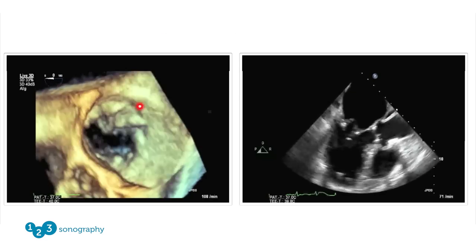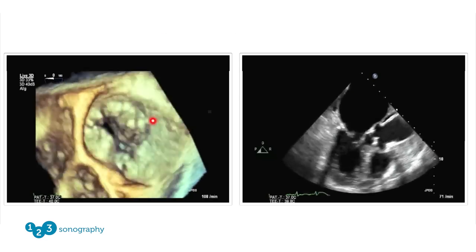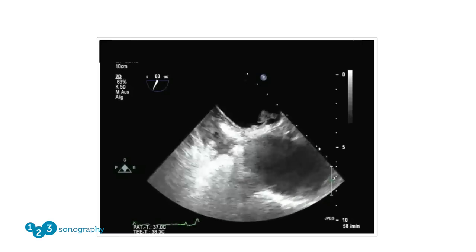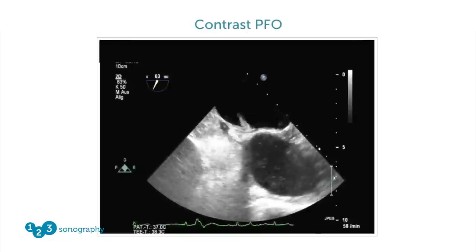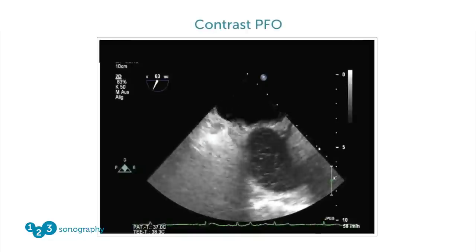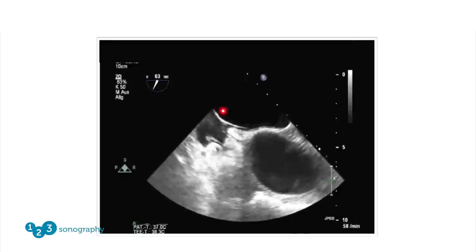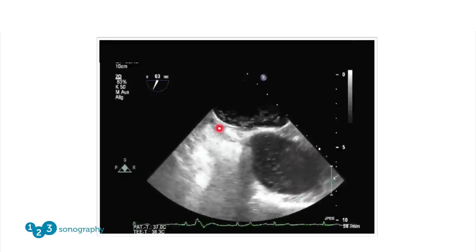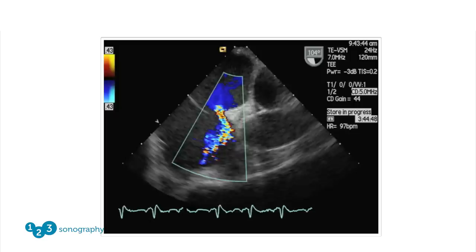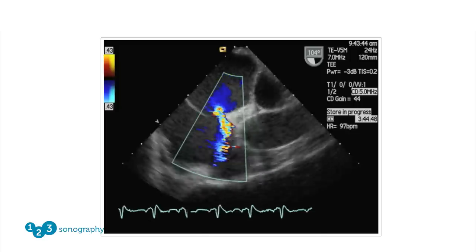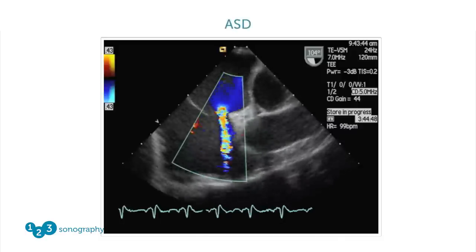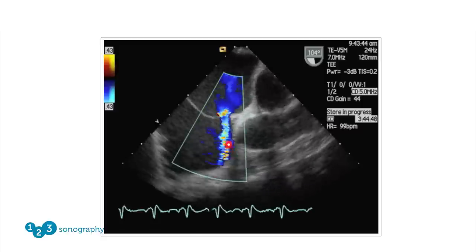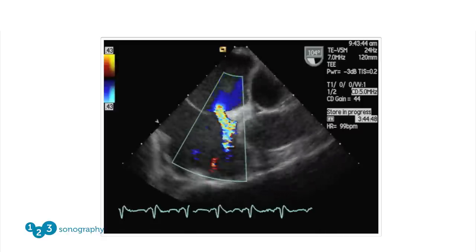We see the protruding part of the posterior leaflet in a patient with mitral valve prolapse. We can even use contrast together with the TEE exam, and thereby document that this patient has an open patent foramen ovale — you can see the contrast passing from the right atrium into the left atrium. Color Doppler documents an atrial septal defect with a shunt right between both chambers.